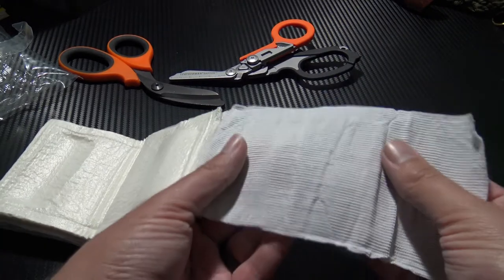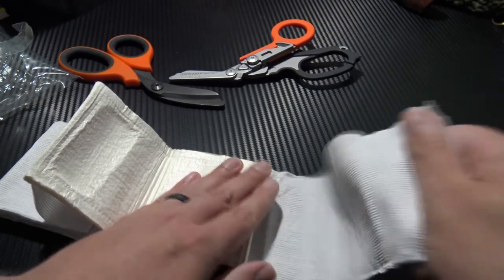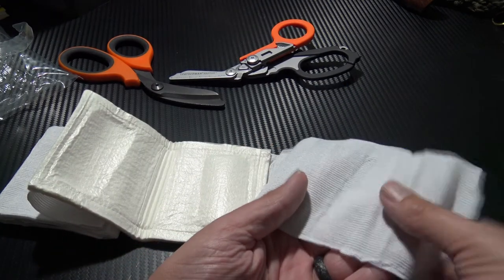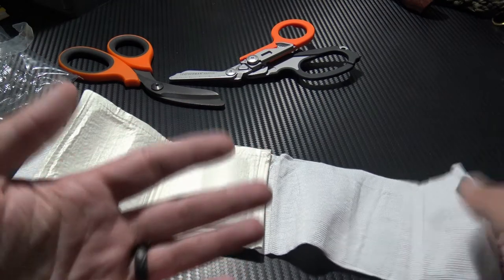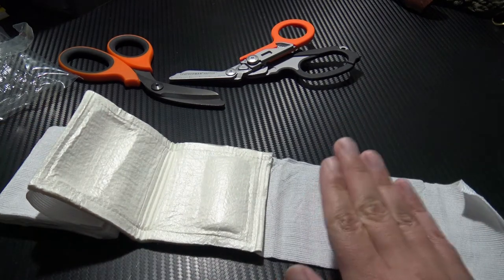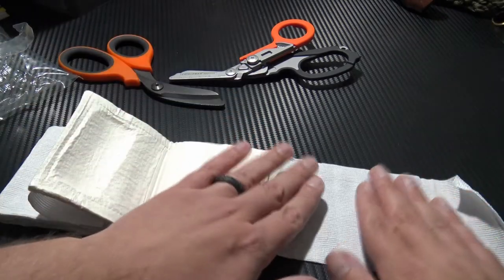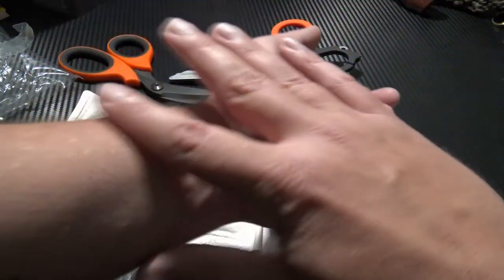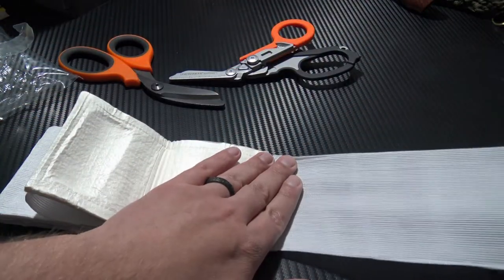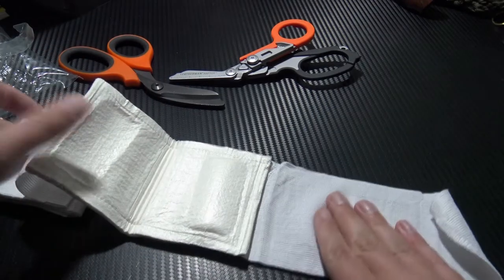The bandage itself is an elasticated material and has two uses. The primary focus is to help you apply really good, firm direct pressure — as you wrap it around you can really pull it tight. It also allows for some expansion in case of swelling at the wound site, so you're not going to cut off circulation beyond the wound.